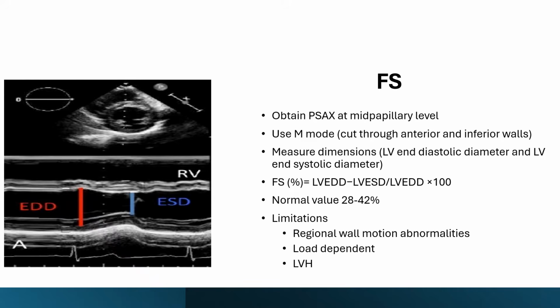In addition to that, left ventricular hypertrophy can overestimate systolic contractility if assessed by fractional shortening. Please pause the video if you need more time to review this important concept.